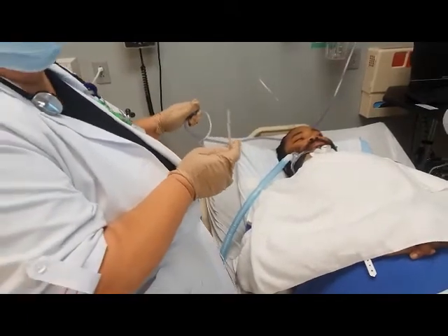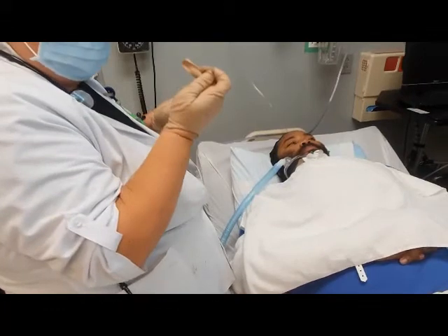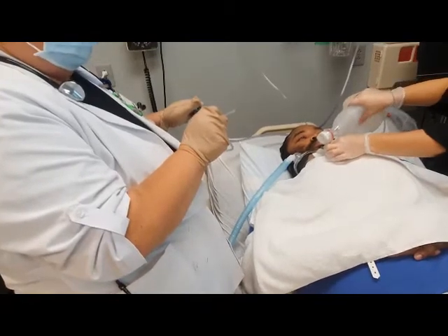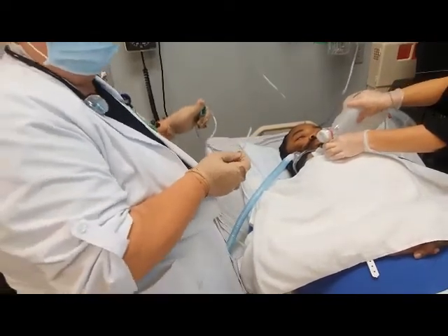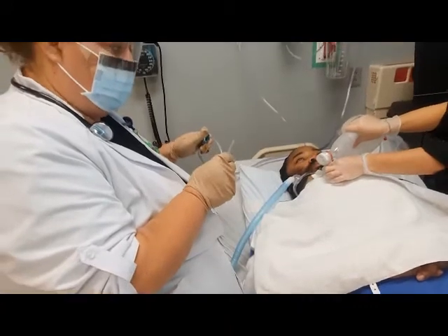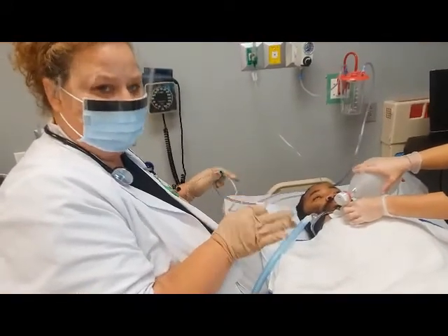Now realize in real life when this is happening, secretions can come flying, so that's why you have the face shield on at this time. She now will attach the bag mask and she will breathe for the patient. Now, during all this time, you've got to watch for these patients to make sure that they're not desatting, because it may be that they are not getting enough oxygen without having the oxygen on itself.